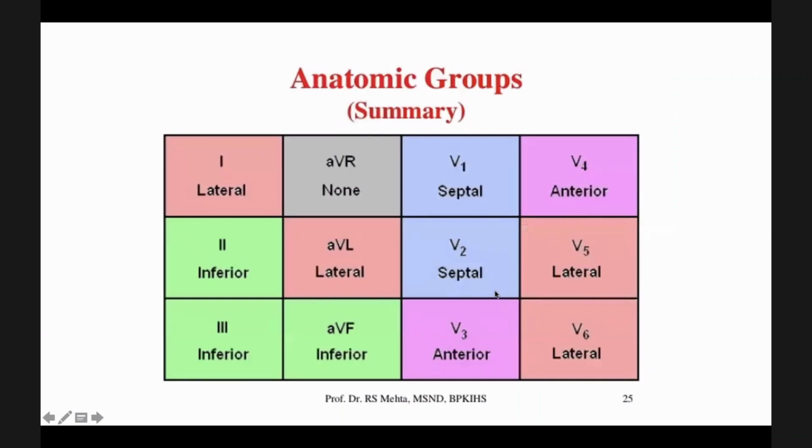The anatomic groups of the ECG leads are very, very important in the diagnosis of acute MI. For that, of course, you should know what the leads are.